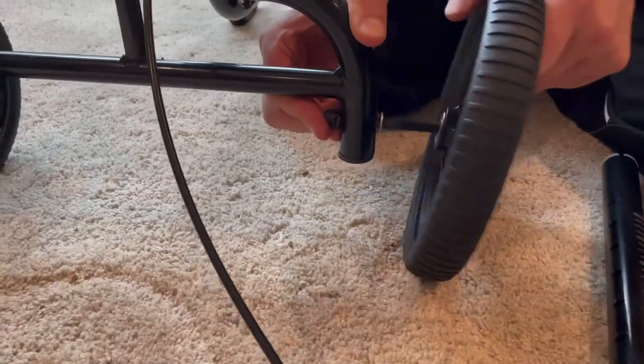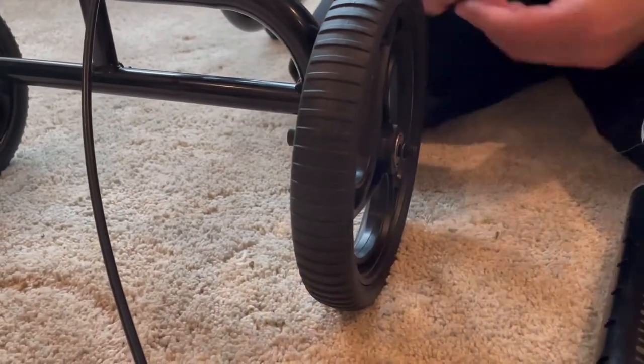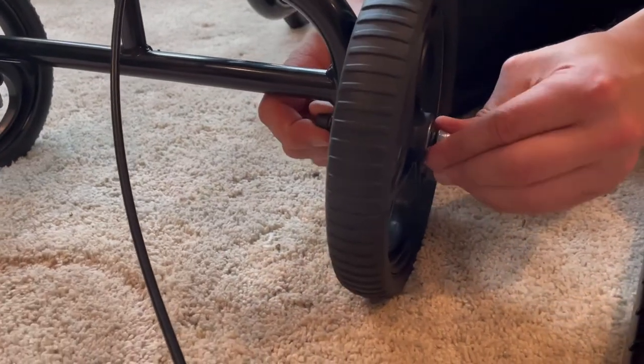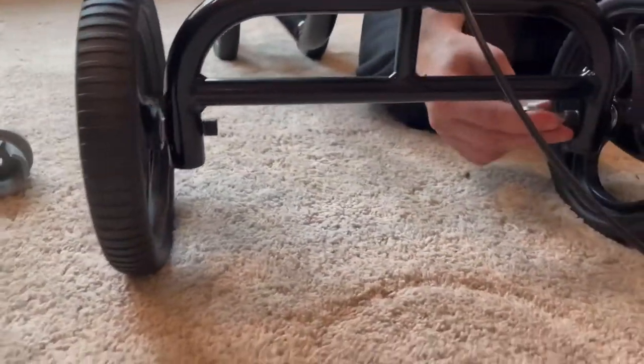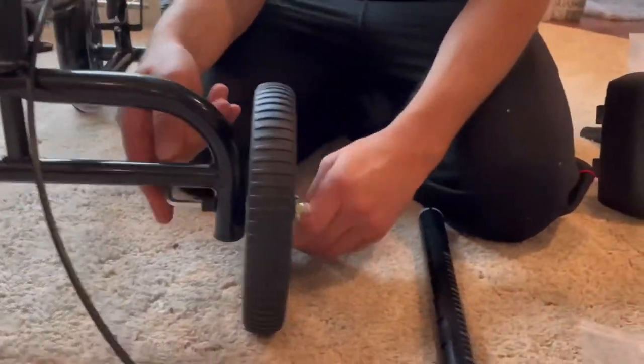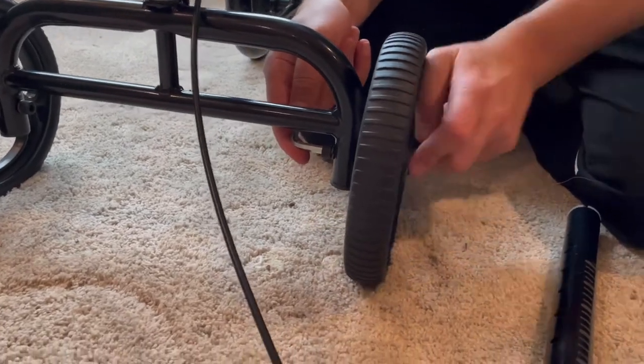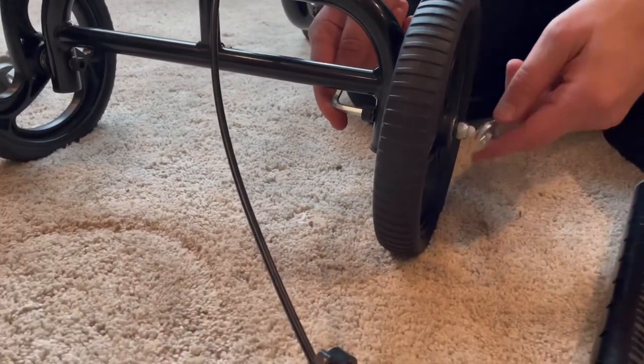Although you do need to install a few items, such as the wheels and the seat, overall this walker is pretty much going to be pre-installed for you. This will allow you to utilize the walker within 10 minutes of installing the wheels and the seat. This walker is going to be perfect for people in the height range between just under 5 feet and about 6 and a half feet.